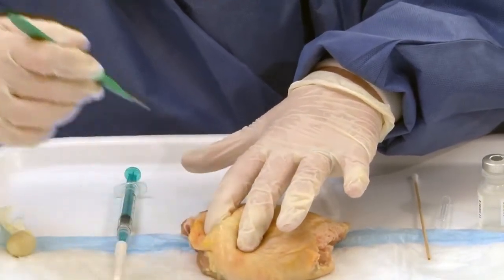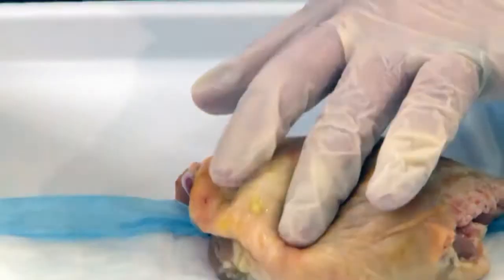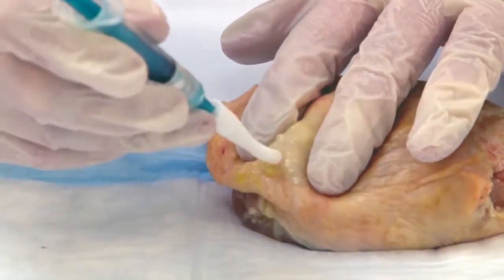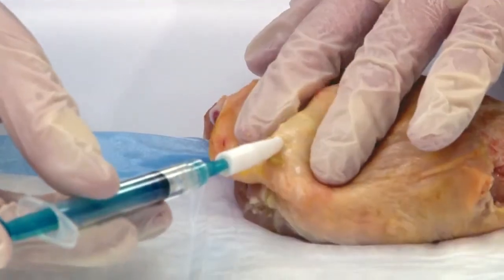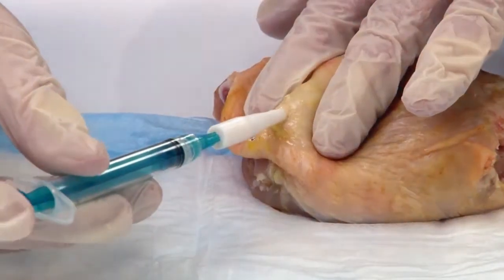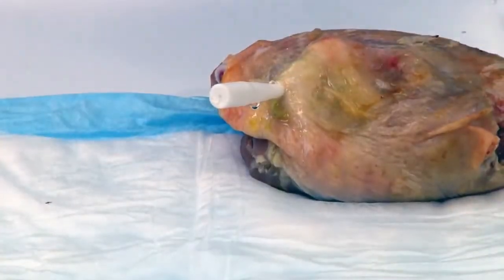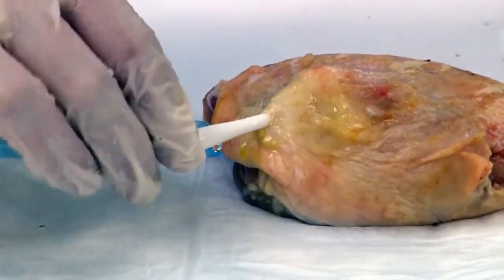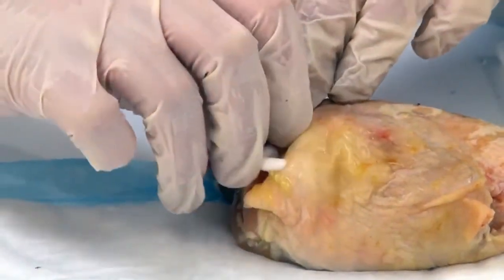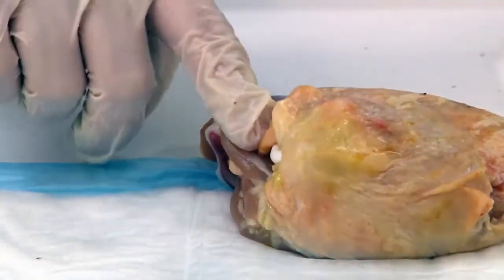And as you can see, the contents are draining. So quickly, before the abscess runs out, you want to insert the Word catheter inside, or you won't be able to. Then I'll gently remove the needle. Make sure that it won't come out, and then I tuck the other side of the Word catheter inside of the vagina. This keeps it from being pulled or snagged otherwise.